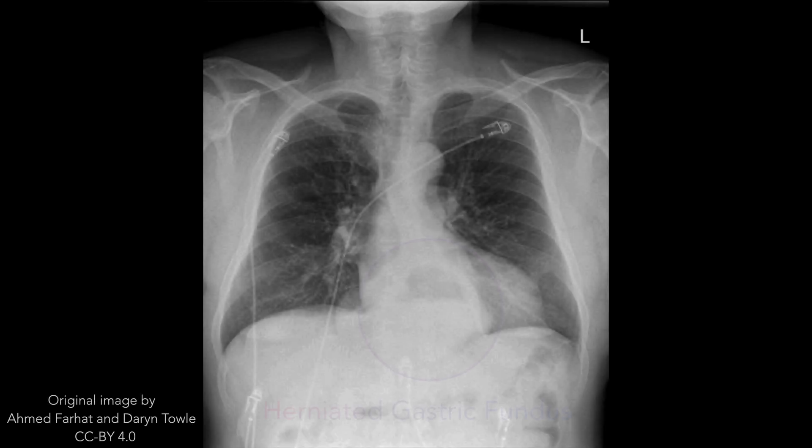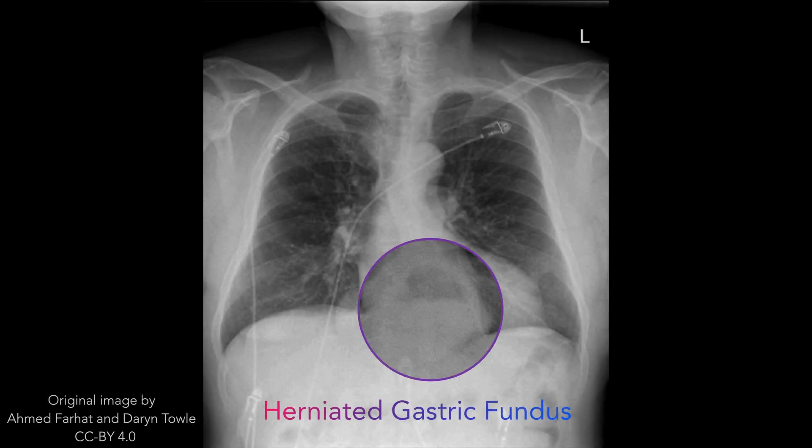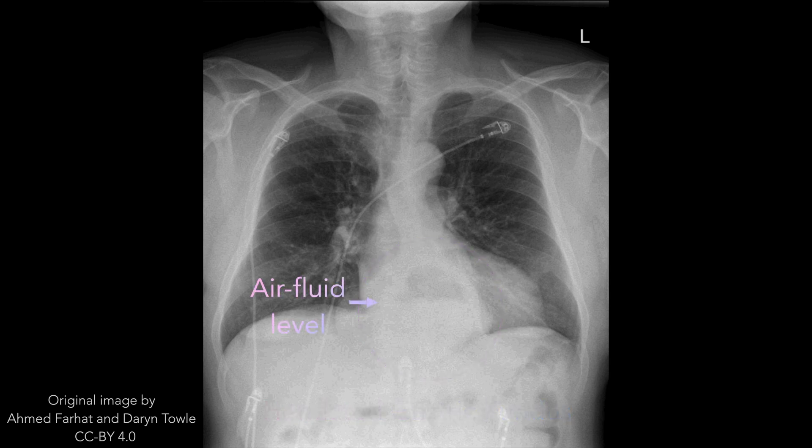Here is another chest X-ray taken of an individual with a hiatal hernia. Note the retrocardiac opacity with an air-fluid level.